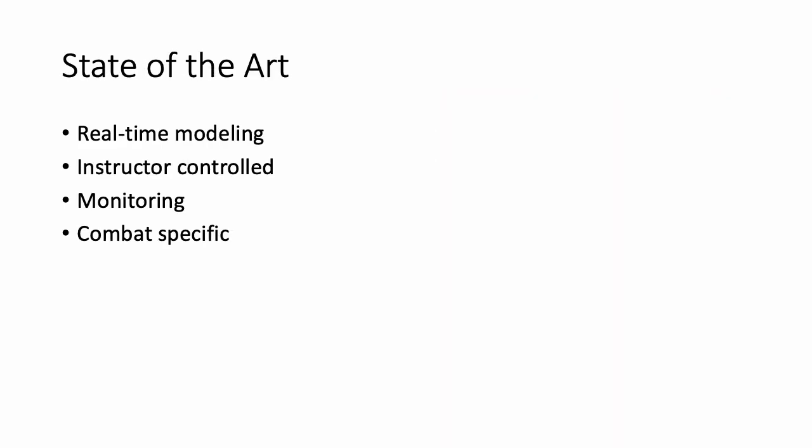Modern systems are very advanced and are used at a variety of hospitals, schools, and training centers. Algorithms can allow the simulators to show shock progression, respiratory failure, and the impacts of medications given. Mannequins can respond to medications given with realistic changes, both negative and positive. Simulation operators can change vitals mid-session, impart complications, and increase or decrease patient difficulty.